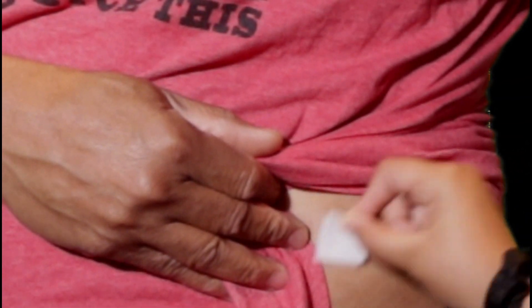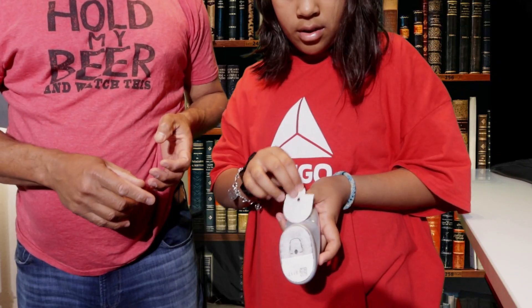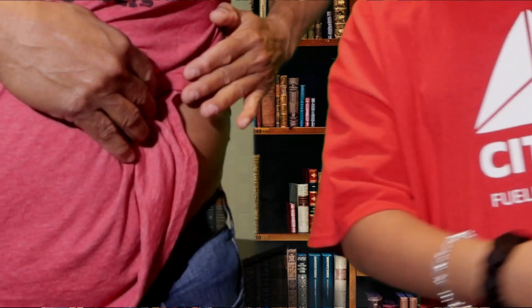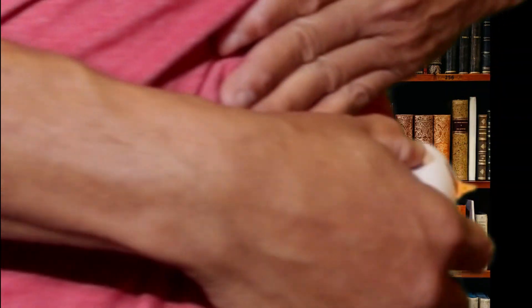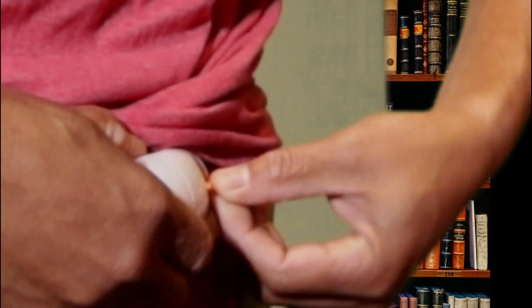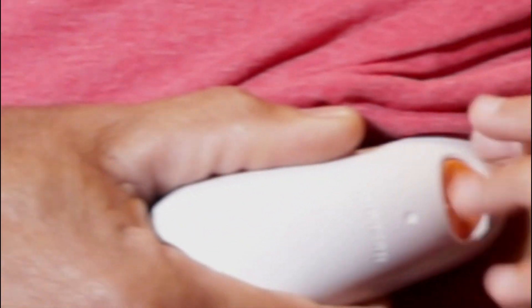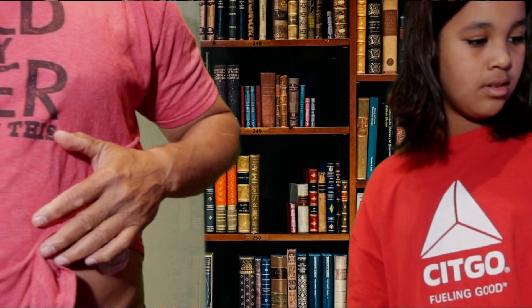We're just going to clean it just like that — that's it. We're going to pull off the sticky backing. Then we stick this on, just a little. Now let me show you — you pull this up, press this button right here, just push it in. And there we go, voilà — it's in.